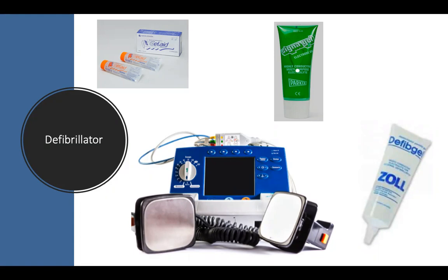And once they get that printout, there is a book that they take this printout and they staple it into, and they write the date to say that the defibrillator has been checked and it is functional. So most nurses have been trained to do this, but it is your duty as a doctor and an anesthetist in theater to make sure that your defibrillator is working. And it doesn't take even 1 minute.